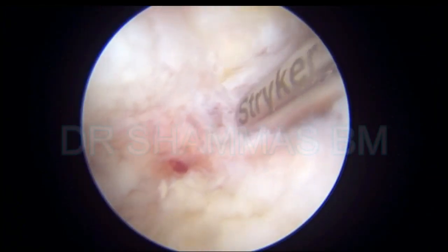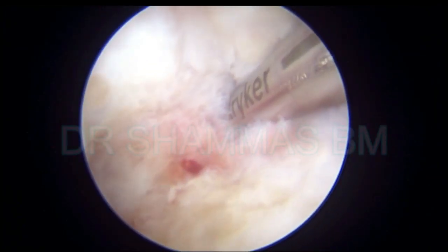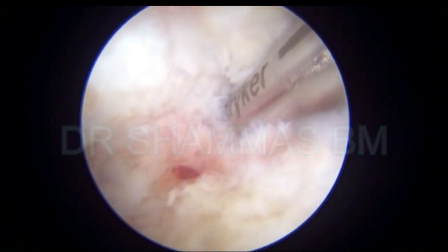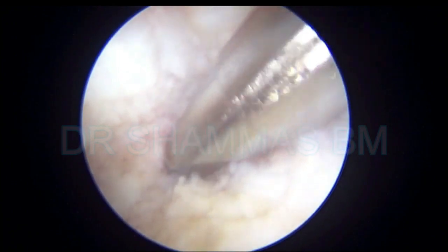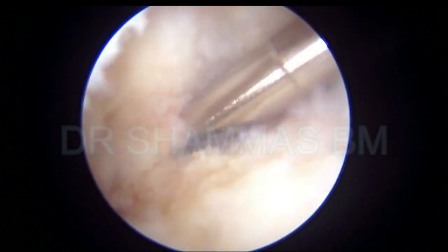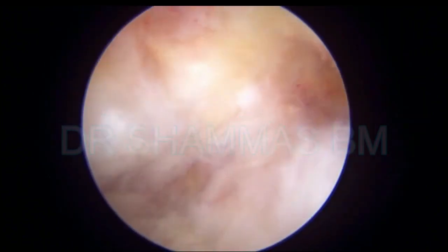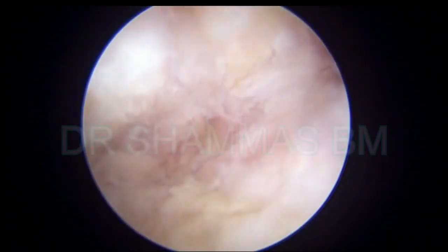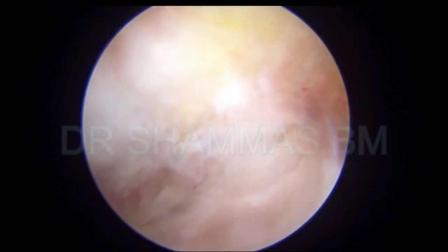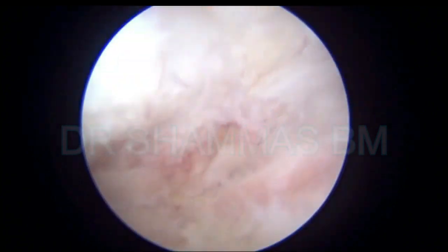So you use different instruments — like the shaver, the debrider, the cutter, bone cutter, and the burr. Now you can see that a small space is found in between the tibia and the talus, and going through the space, again clearing all the fibrosis and the scar tissue. You should be patiently doing all this.